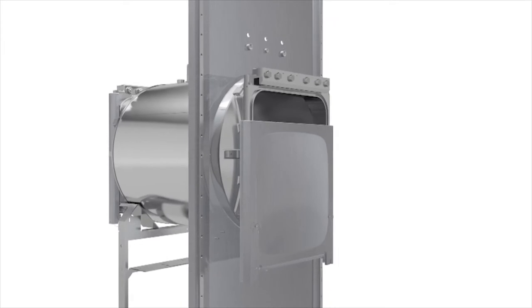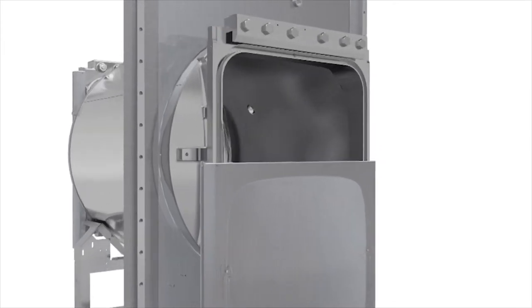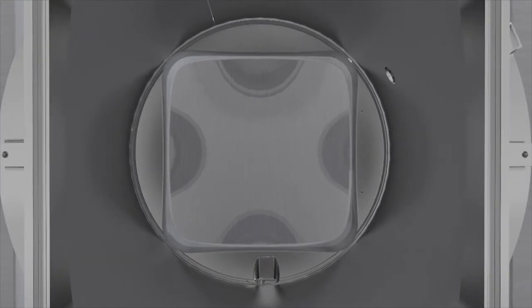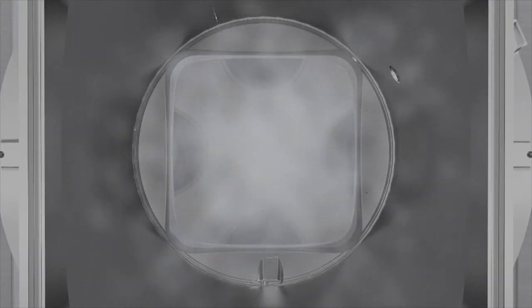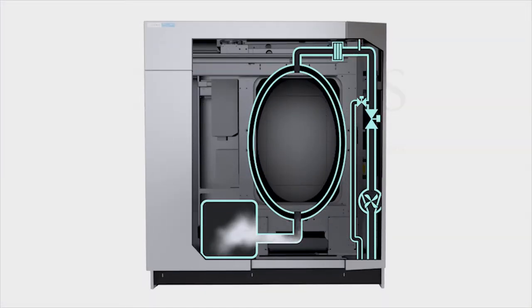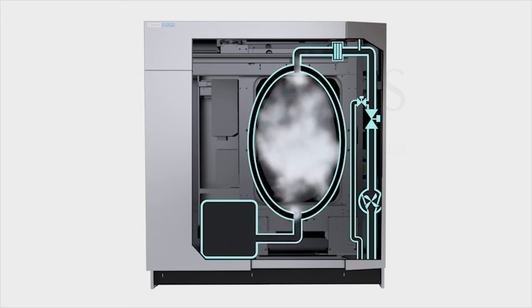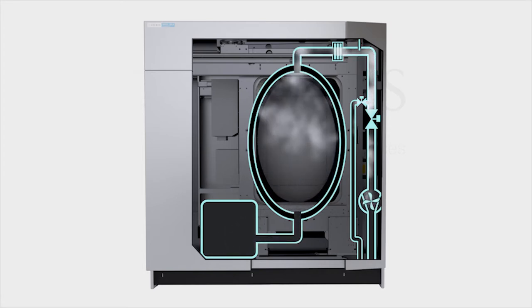Double door sterilizers can be fitted with an optional air differential seal to minimize the flow of air between the non-sterile and sterile areas, or a bio-seal for an absolute barrier. The optional effluent decontamination cycle is designed to contain any hazardous or contaminated waste, preventing it from being released into the environment.